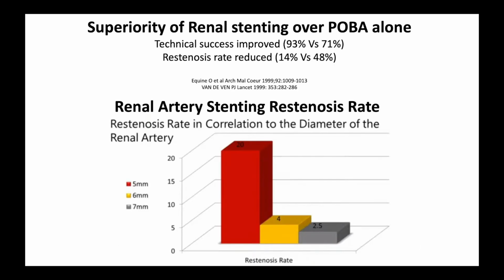The first renal artery balloon angioplasty was done by Andreas Gruntzig in Zurich in 1977. For atherosclerotic renal artery stenosis, stenting is the therapy of choice, with annual ISR rates of about 10% with current devices. You must remember that renal arteries with a diameter of 5 mm or less have a 20% risk of ISR with bare metal stents and should get a drug-eluting stent. And ISR is then treated with restenting and angioplasty, or drug-coated balloons that are now available.